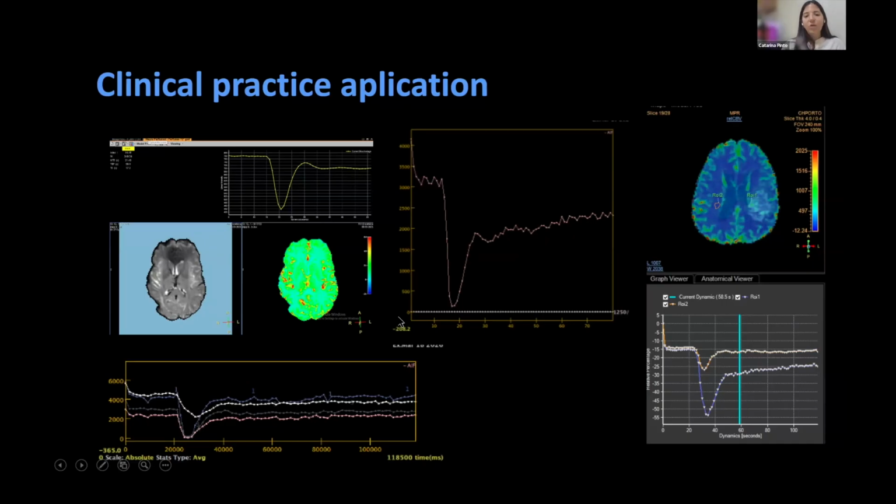It is really important that we are aware of the different shapes of the curve. Sometimes the curves look like this just because of the scale, but still in this case, you can see that in the mean slice there was this big drop of the curve and almost a total recovery of the signal. And on the tumor, you can see that this recovery is not that big.